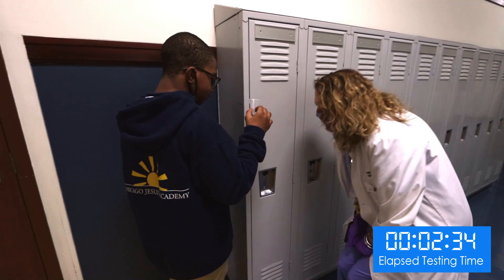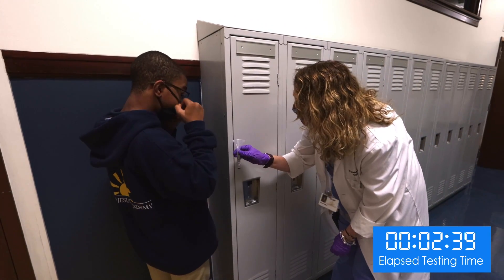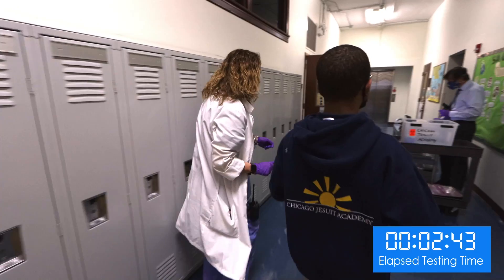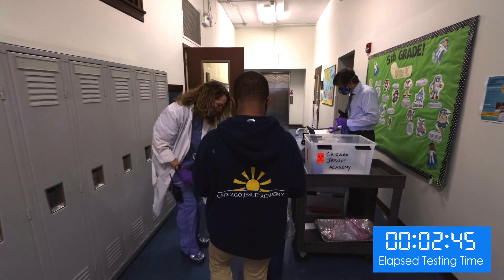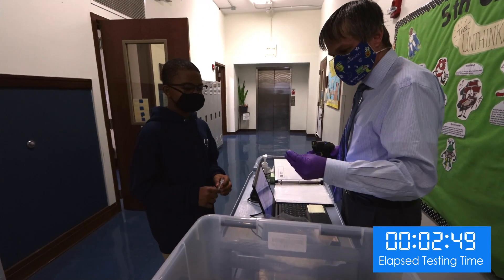After producing enough saliva to fill the vial, a staff member checks his sample and sends him to the checkout station. He removes the funnel and discards it, then places the cap on the test tube.